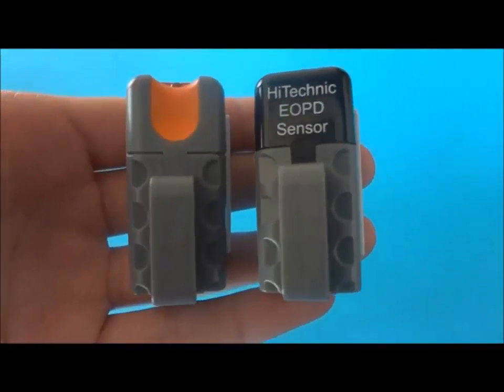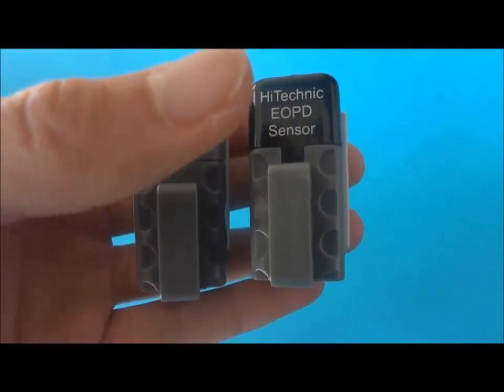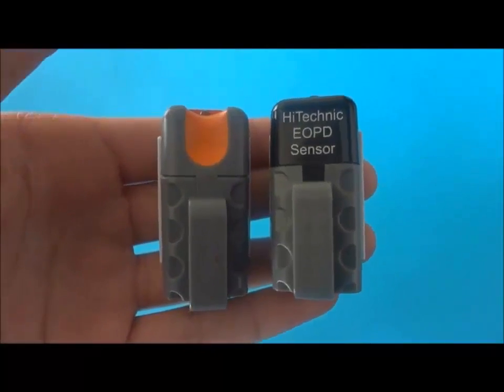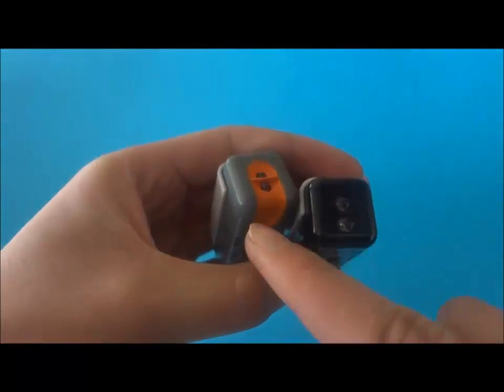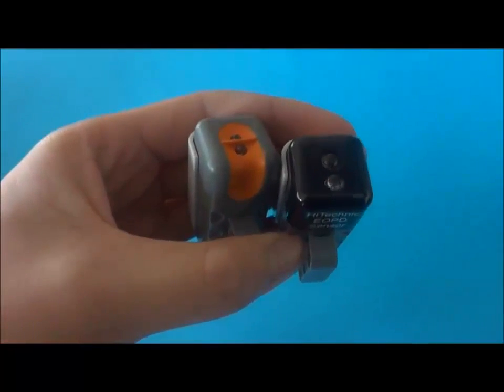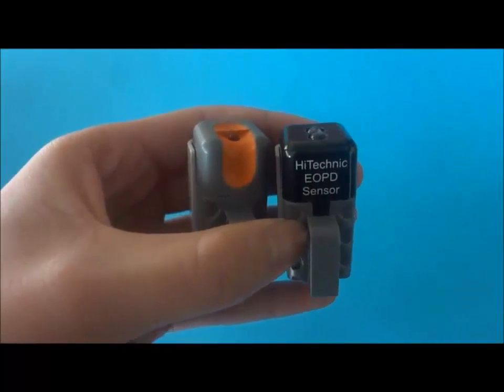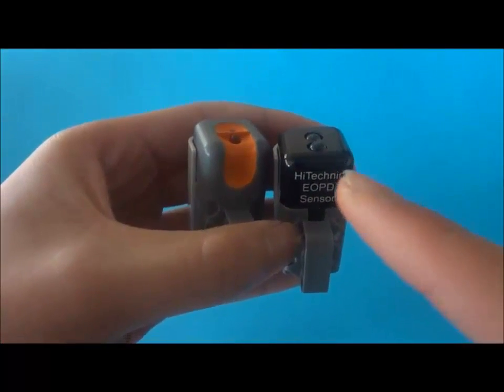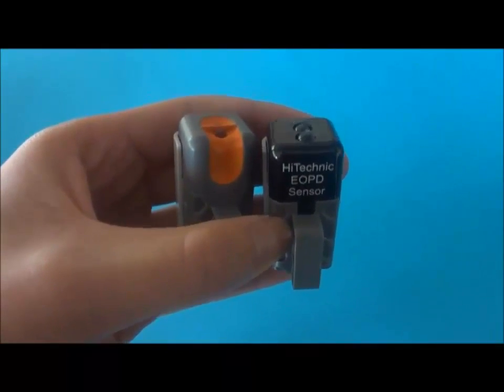I also have two light sensors, one each from HiTechnic and LEGO. Both can measure distances using reflected light and are very accurate. However, the LEGO light sensor is very sensitive to changes in ambient light, and so we have problems going from indoors to outdoors. The HiTechnic one, however, uses pulsed light, which is insensitive to ambient light changes. This, we thought, was the best so far.